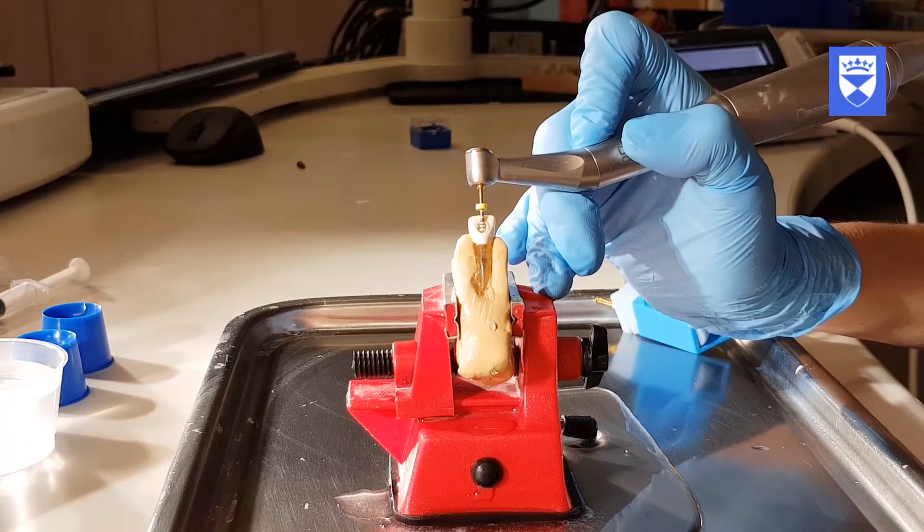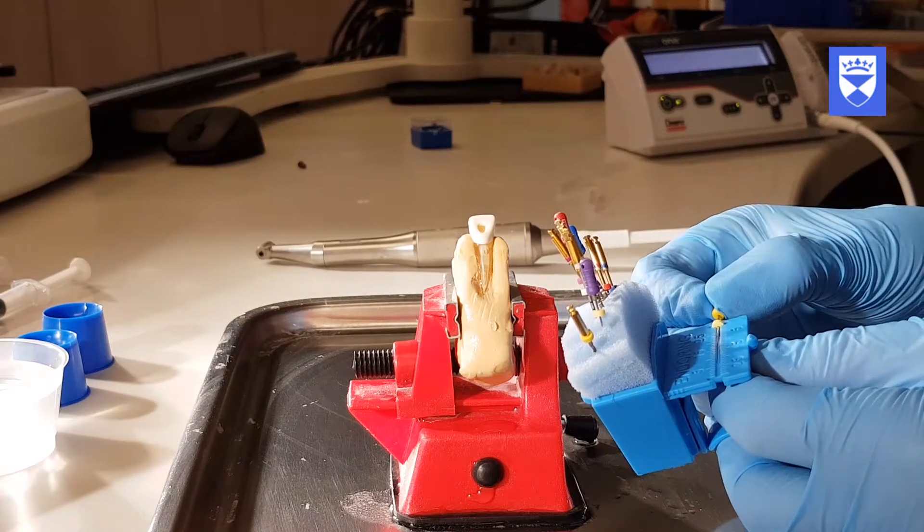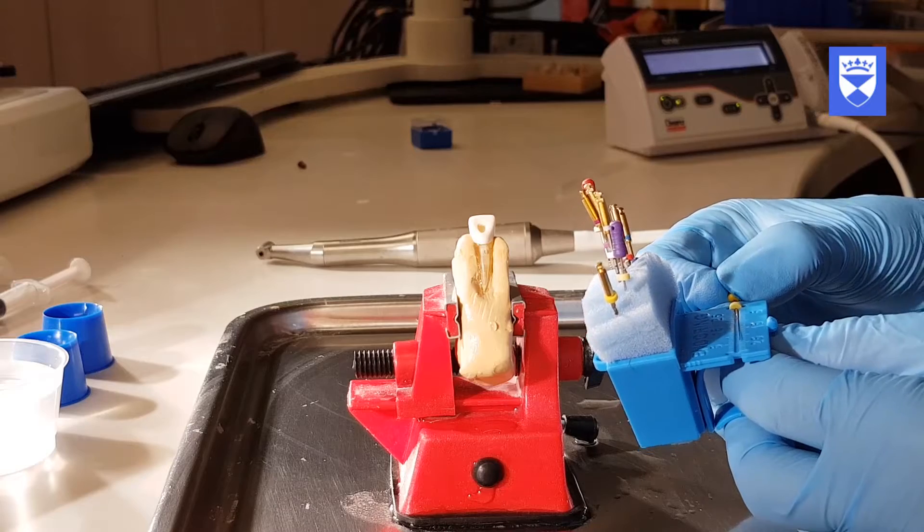A corresponding size flexofile is then used to gauge the apical constriction. If the file passes the apical constriction, move on to a larger finishing file.